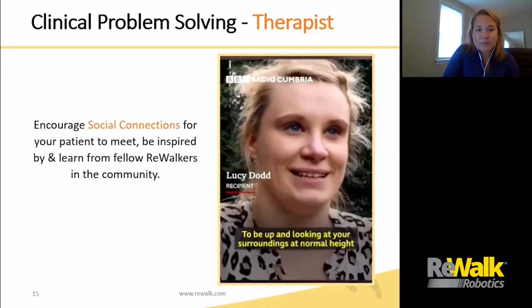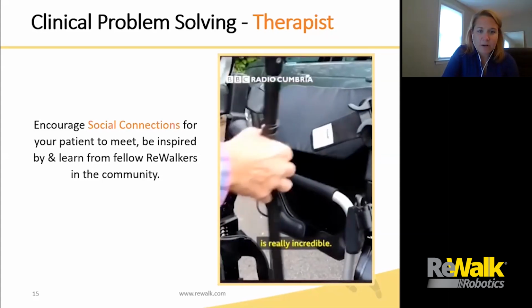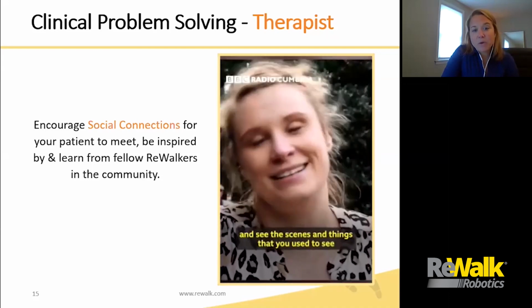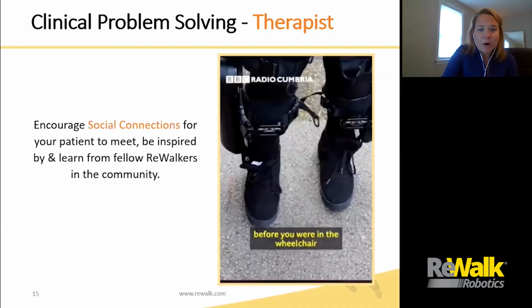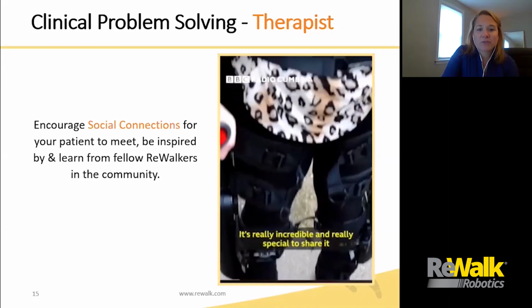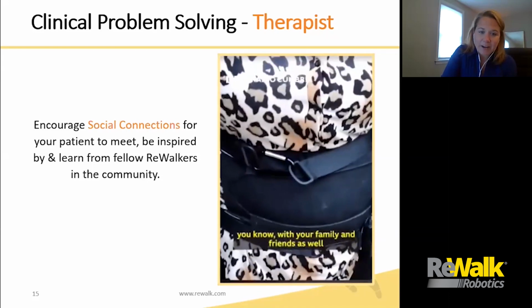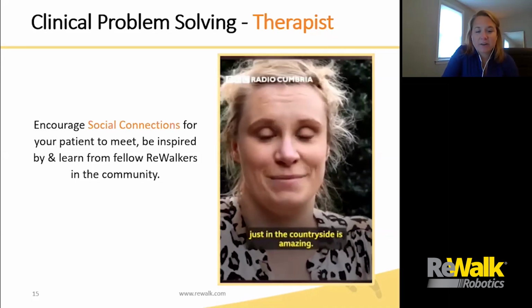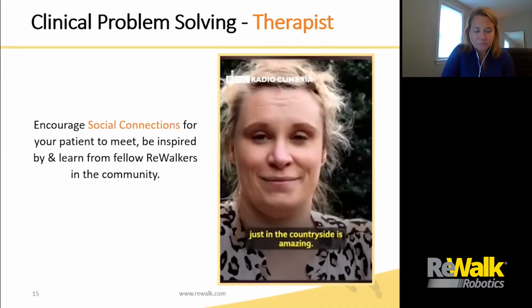This is a really great story that was broadcast on the BBC of a veteran ReWalker helping a new ReWalker have the confidence to try and take it to the next step of actually walking with it outdoors and almost hands off. You can see that her therapist behind her is definitely hovering, doing the hovering technique that we had just talked about. So definitely encourage social connections for your patient to meet, be inspired by, and learn from other ReWalkers in their community.